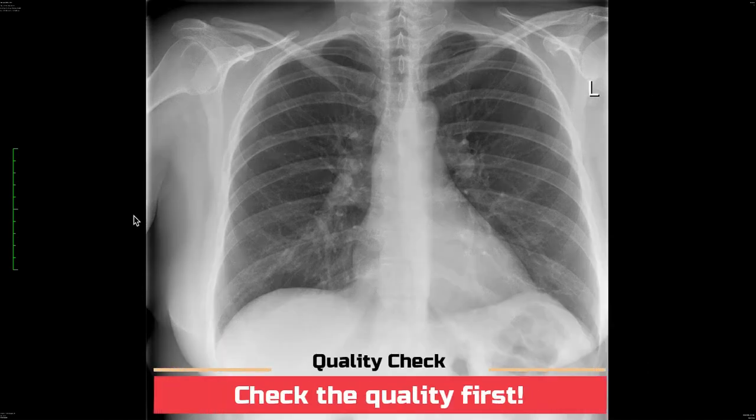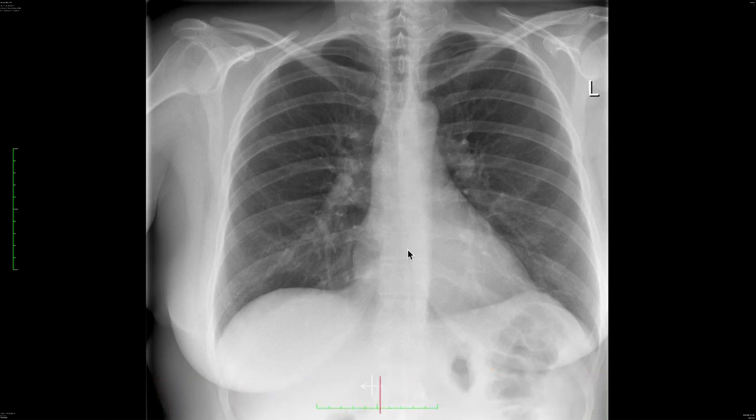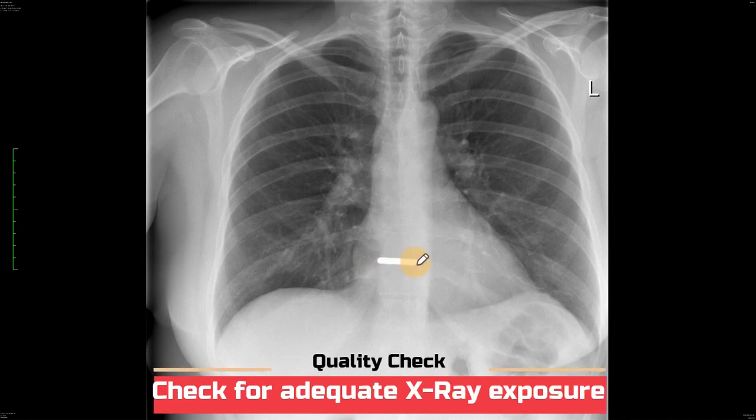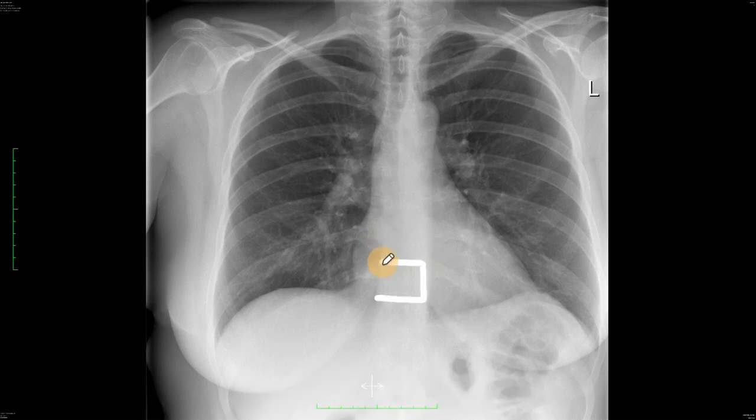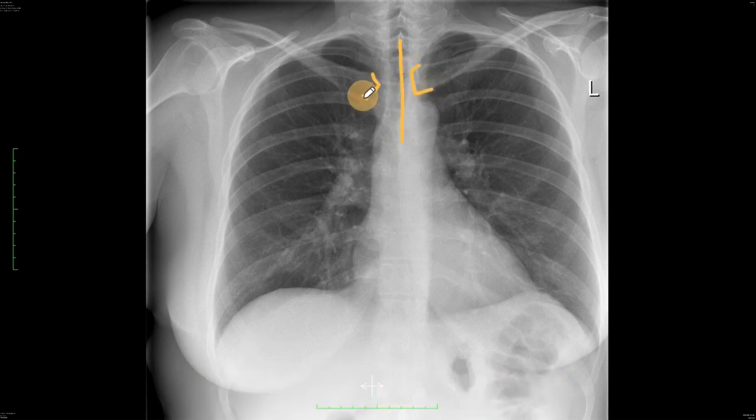Before you start reporting a chest radiograph you need to make sure that the quality of the radiograph is adequate for reporting. We do this by checking that we can faintly draw a border around the vertebral body in this region - it should be just barely visible. The second thing to check for quality is to make sure the patient is well centralized by drawing a line through the spinous processes and then along the medial end of the left and right clavicle - this space should be the same on both sides.